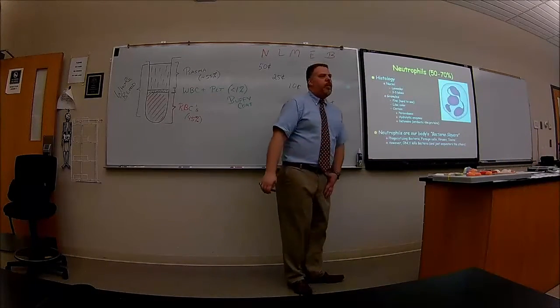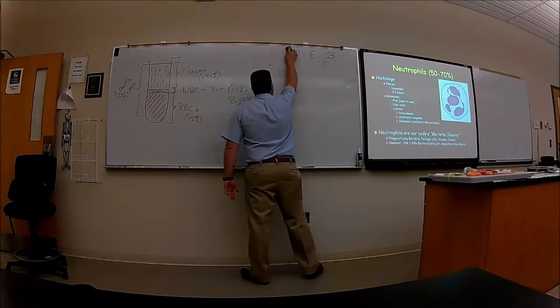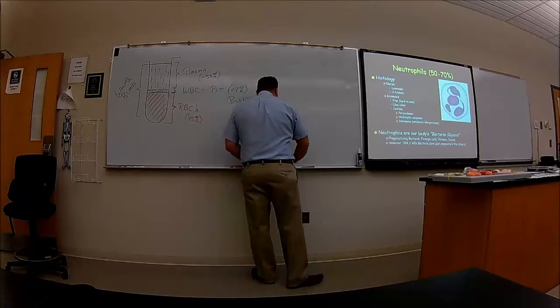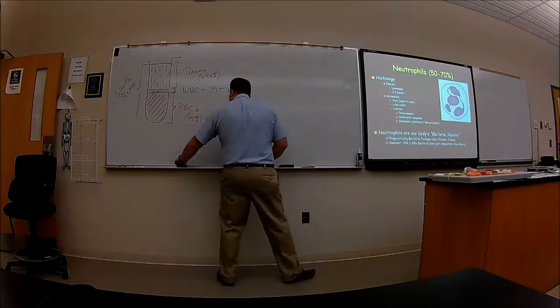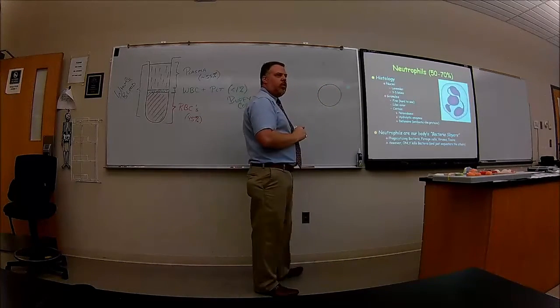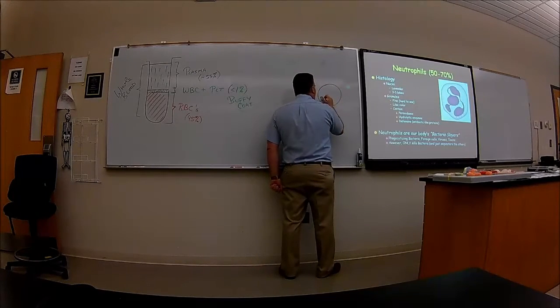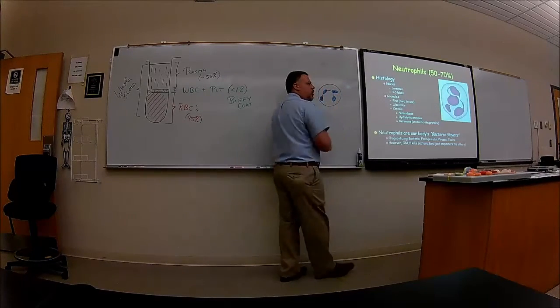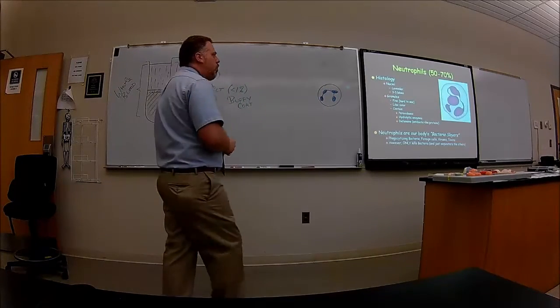Neutrophils, 50 to 70%. This is the most numerous that we have here. You're seeing that the cells themselves have some sort of weird shape. The nucleus has a weird shape. So what happens here is that we have a white blood cell, neutrophil, and its nucleus is what we call lobed. There's a lobe there and a little string, a lobe there and a little string, a lobe there and a little string, a lobe there. That's how it's shaped up. It's lobed is what we say.